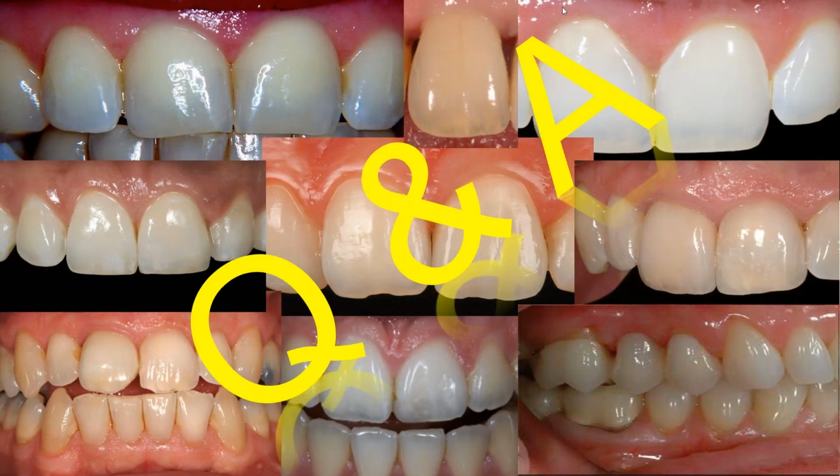So let me see about any questions here that we may have had. I haven't been able to check it as we go. So the question here: why 3D Master if I don't find any difficulty using the classical? Well, I think a lot of the issue is that when you look at the stats, many remakes are done because of a color shade mismatch.